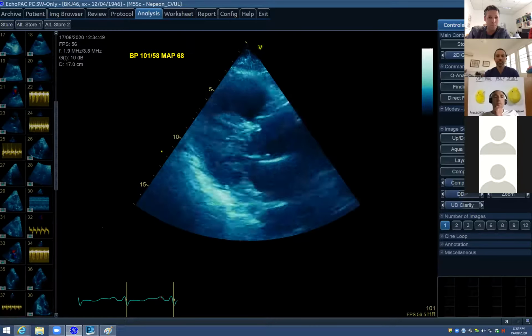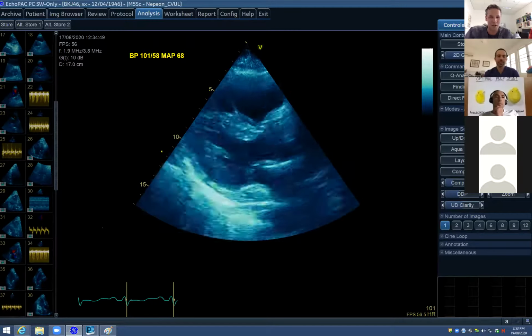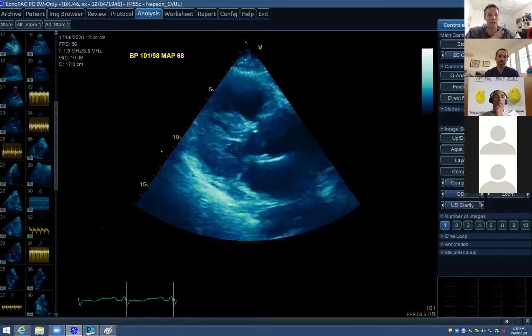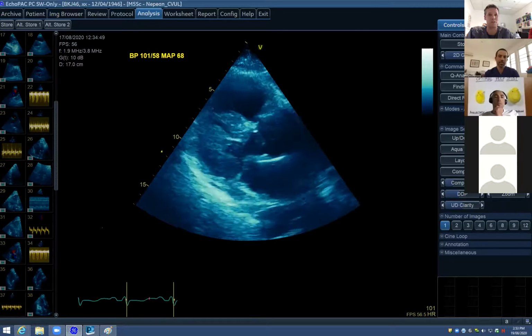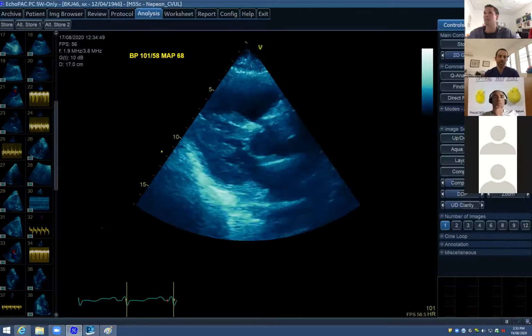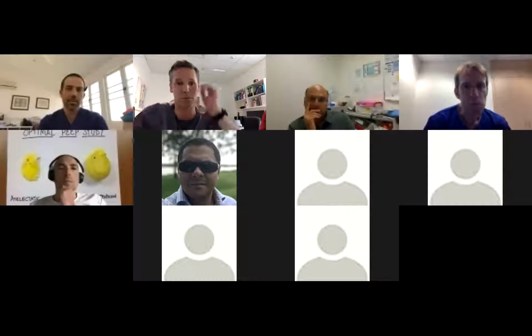How much PEEP are you giving? What an interesting question. Let's go on to that now, because that's the other bit I want to show you. So he had a marked improvement with reduction of PEEP from 8 to 6, beautiful, as well as no major contribution from LV failure. So her team has helped look after this gentleman, and I think the fact that his LV carried on working was absolutely instrumental to it as well. Yeah, very nice. What I want to show you next is this.